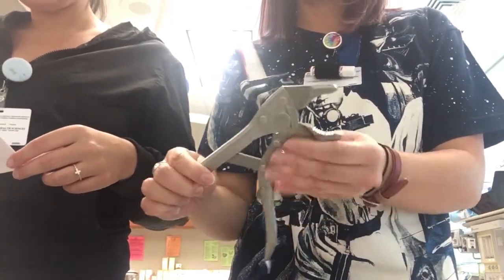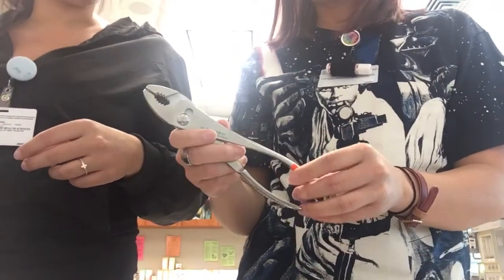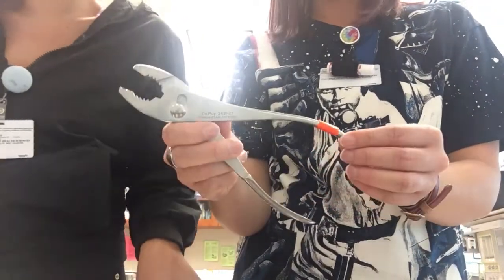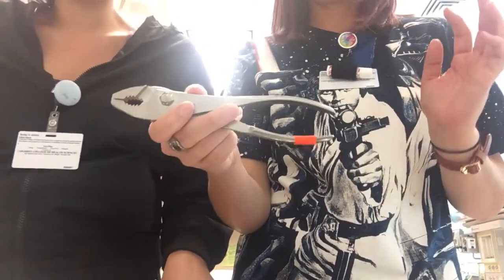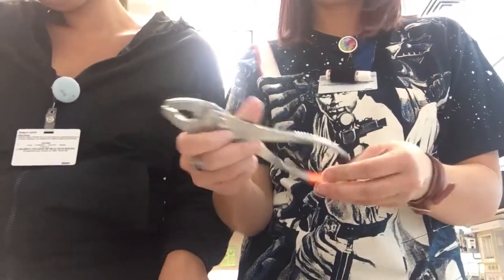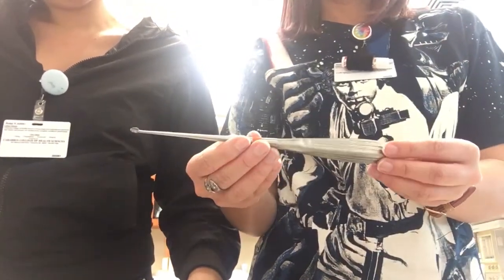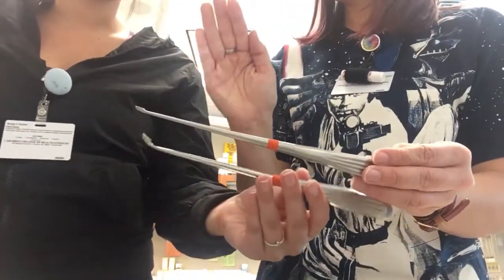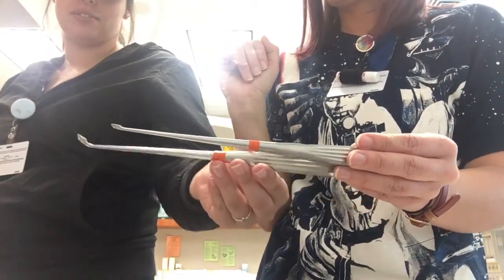Obviously you grab stuff with it. And then we have pliers — these are pliers. Obviously these two are just like the regular ones you can get in a toolbox but they're for surgery. This is a straight bone cutter, and then we also have a straight bone curette and a curved bone curette.